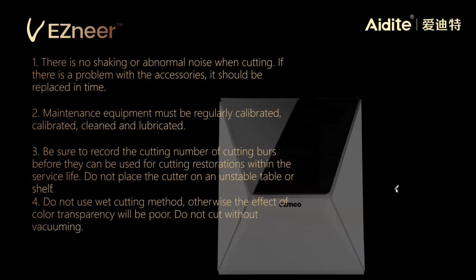And the next step is milling, and it's also not too different from the normal milling. Just don't let your milling machine move, we need to check the milling burs.